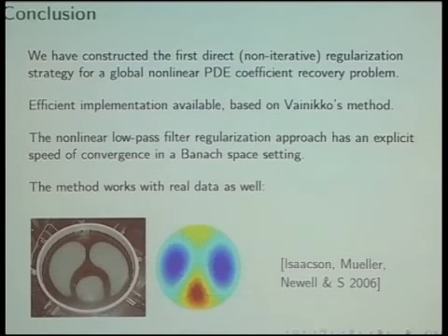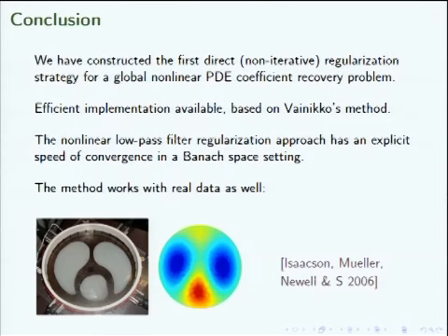So to conclude, I would say that we have here the first non-iterative direct regularization method for a full nonlinear global PDE coefficient recovery problem. It works in practice. Here is one example when we apply it to real measured data. It can also be applied to human data. We are in the process of doing it. We have done it with some Born approximation step and got really nice videos of people's breathing. So I would say that here is an instance where numerical complex geometric optics solutions can help medical imaging.